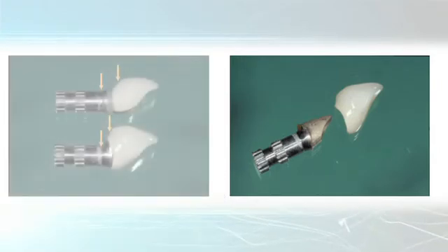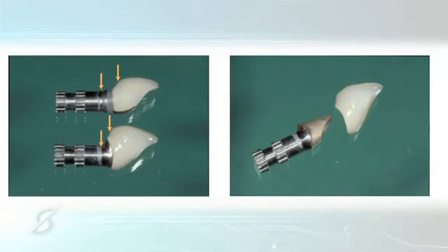In designing the whole crown, one of the key facts is now when this gold abutment's made, or whatever abutment you're using for your cemented crown, it's important that your technician keeps the margin of it about 1.5 millimeters subgingival, not much more, so you can easily clean all the cement up. But you can again compare my final restoration on the bottom with the previous final restoration on the top.